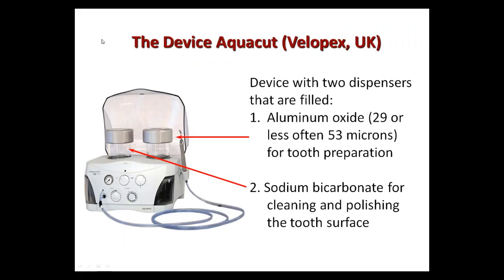As for the device, for example, AquaCut by Velopex company. This is a device with two dispensers that are filled with two types of powder.